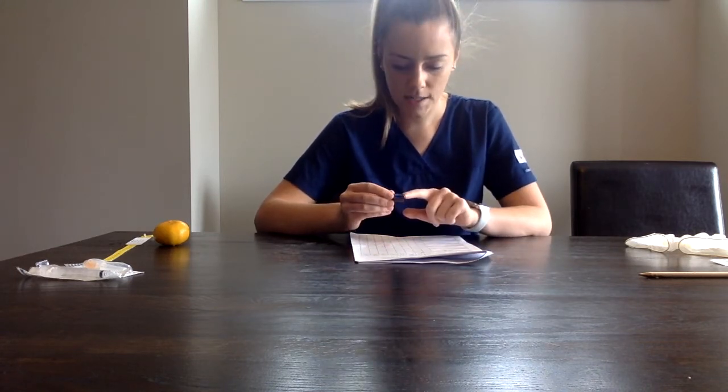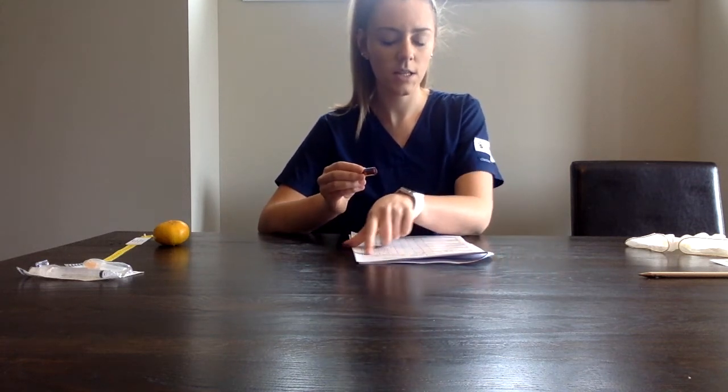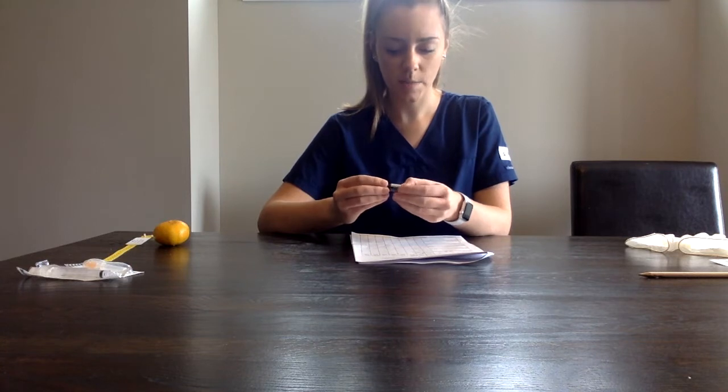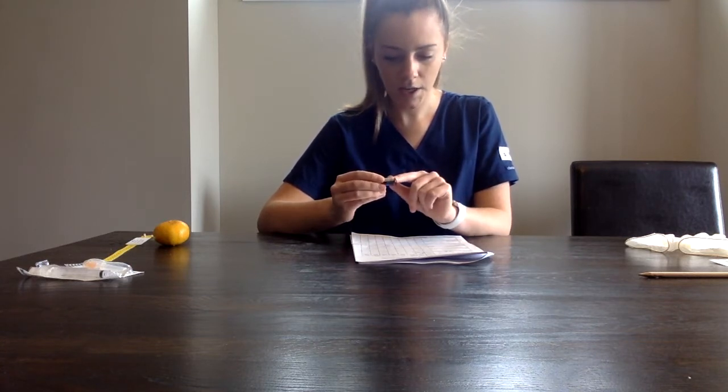It's subcut, and I see here is SC for subcut, and it's given BID. We have our two time frames. It's March 10th, the year is 2022, and we're giving for the 2030 time frame. We also want to make sure this drug has not expired, so I'm going to look for an expiry date, and I see it here. It has not expired yet, so we're okay to continue with this medication.